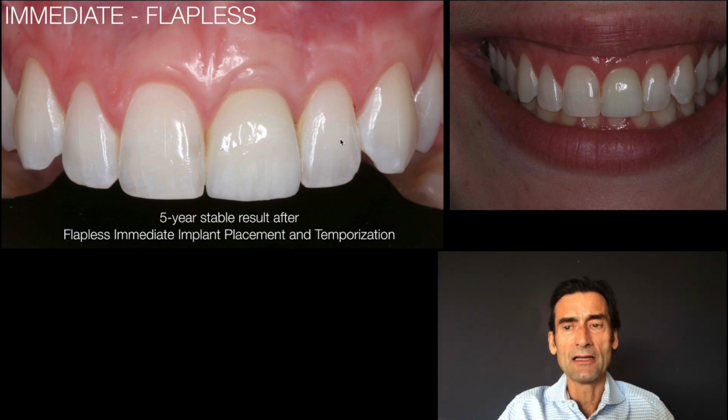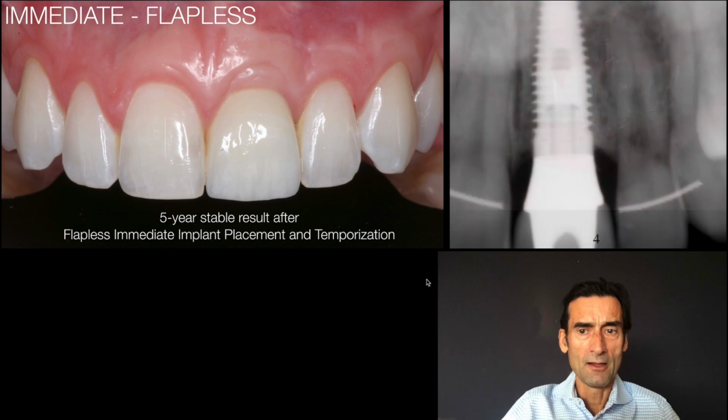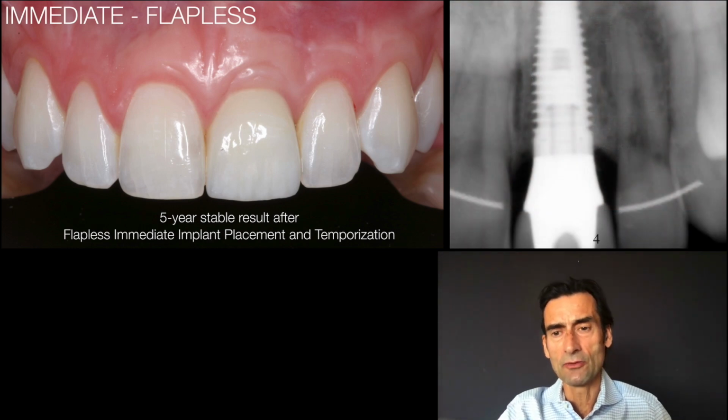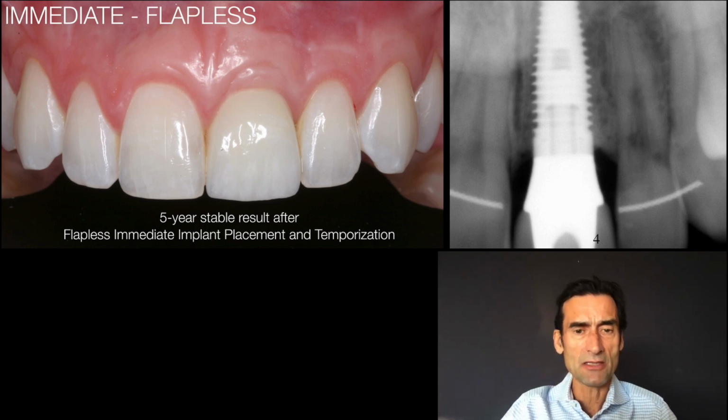And you can see in a high gingival display, this crown looks pretty much like a natural tooth, which you can see adjacent to this crown. And here you can see a close-up view, again, of a periapical x-ray, and you can see how the implant is maintaining crestal bone. You can see here the custom abutment, how well it's emerging from the implant, narrow at the crest of the implant, and of course then here the crown cemented on this site.